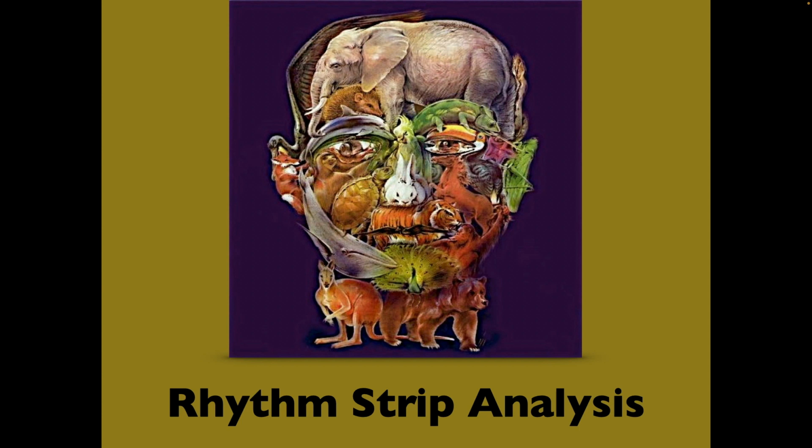Gosh, what's left? Koa, where relative to the ECG strip is the relative refractory period? It's right after the QRS, so is it going from the S to the T? Mhm. So for the relative refractory period, remember there are two parts of the refractory period. There's the first one, the absolute refractory period, but the one that we're most concerned about is the relative refractory period.